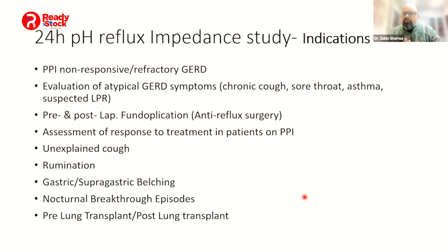Lung transplant: reflux is a major contributor for them to develop chronic rejection. So in all these clinical situations, you do this. So remember, when you're analyzing the report, if you are not putting in the clinical context, it's just a waste of money.